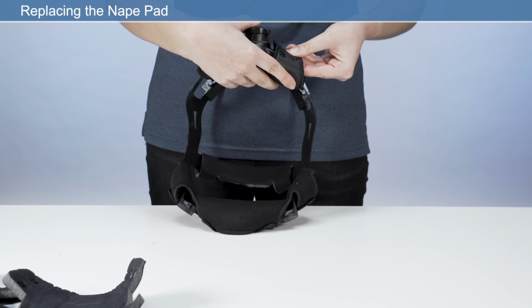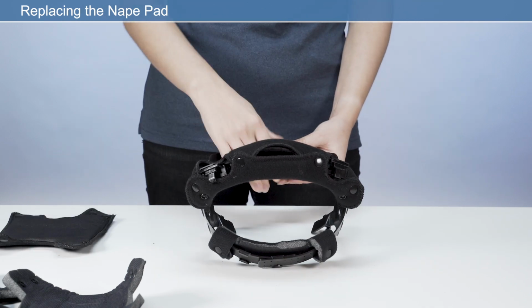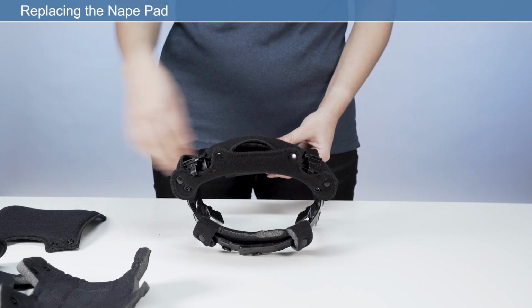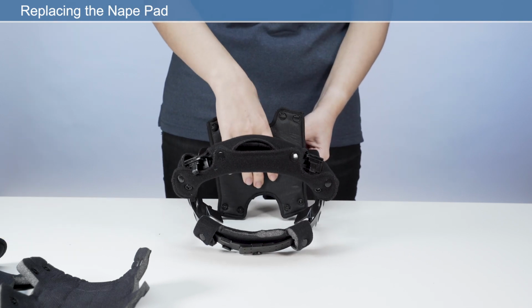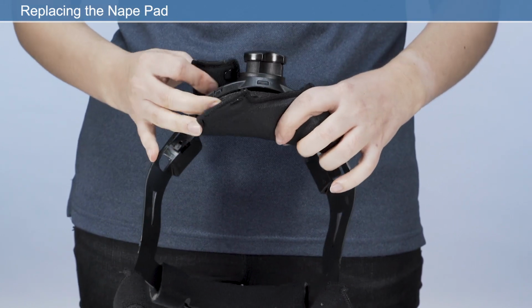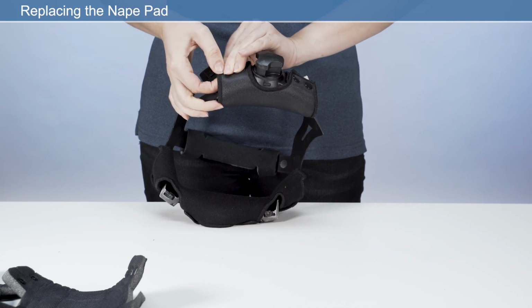Nape pad. Detach the press fasteners from the nape comfort pad and remove from the headband. Retain nape pad if this is not being replaced. Place the new nape pad, if being replaced, onto the headband adjuster and wrap the new nape comfort pad around the headband adjuster and secure the press fasteners. Ensure the perforated side of the pad is facing the user's skin.